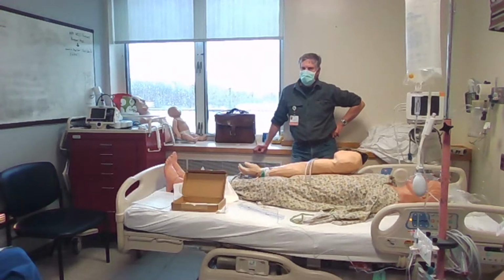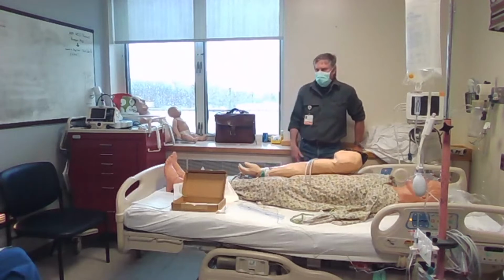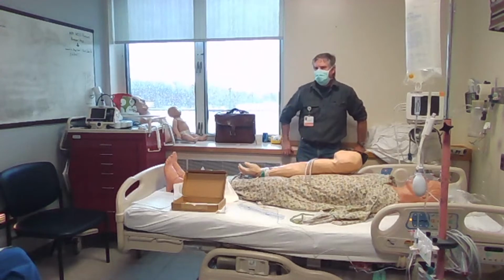Yeah, generally, if the patient's that sick, we'd be getting them for blood pressures usually. If we can't get reliable blood pressures, they're gonna be transported pretty darn quick. And if it's gonna be that quick, a lot of times you're just watching their non-invasive blood pressure. You've got enough time because you're pouring fluid into them. Number one on the resuscitation algorithm for someone who's hypotensive is fluid, crystalloid. Next is packed red cells. So yeah, we just haven't used them. It's not very common. If we had a bunch of people that were really comfortable with them, maybe we'd use them more, but historically, we have not.